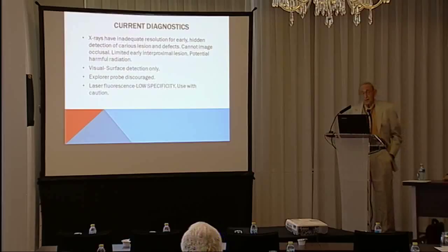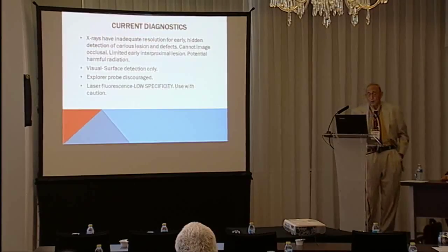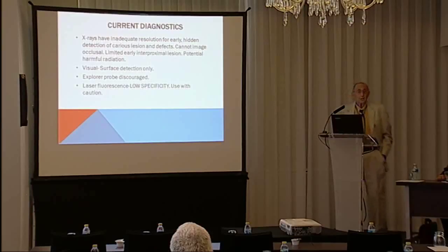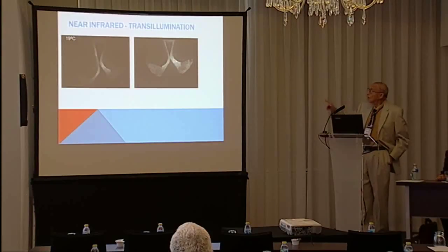You should also have visual surface detection only. We discourage the use of the Explorer probe and laser fluorescence, low specificity. You've got to use that with caution. This is near infrared transillumination.